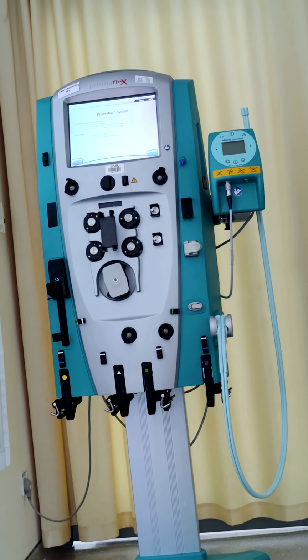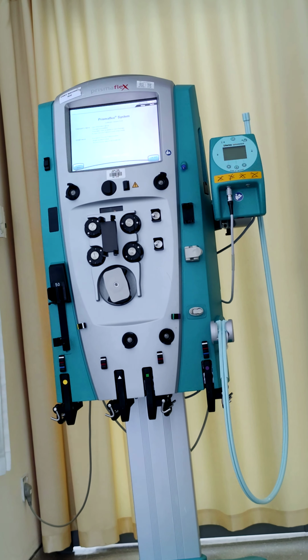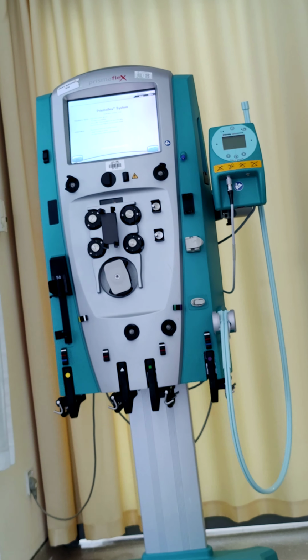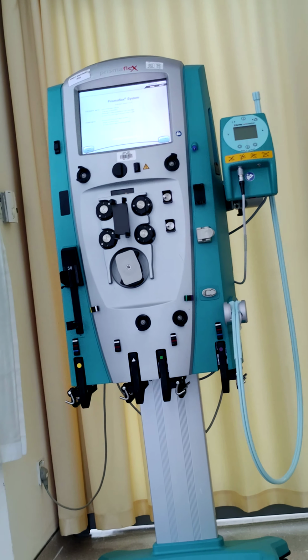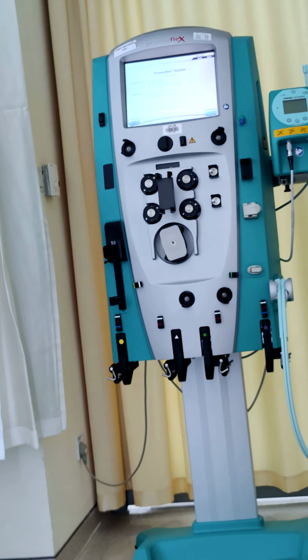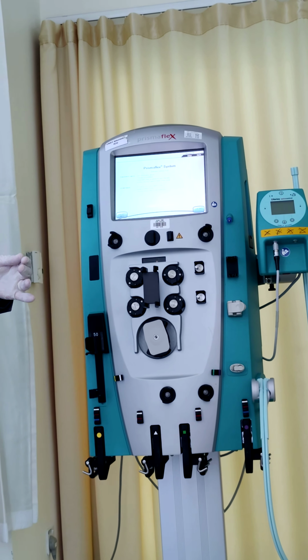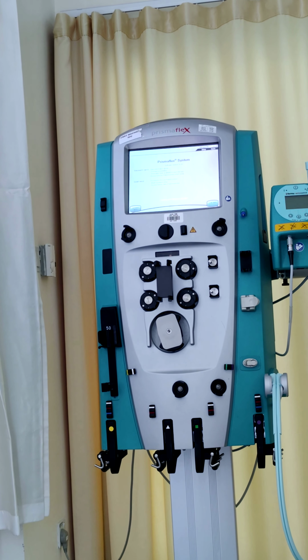For how long can this therapy be kept, how many hours? It's between 2 and 4 hours, depending mainly on the body weight of the patient. If you have a small adult, 2 hours or 2.5 could be enough.